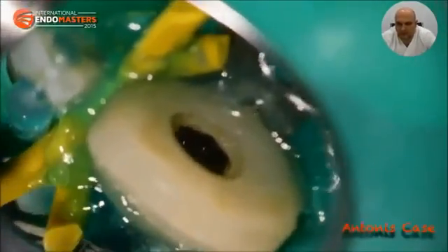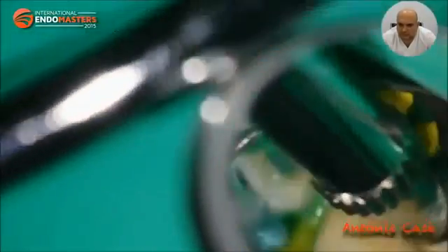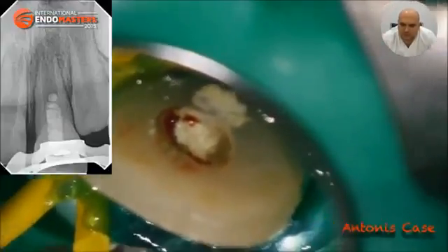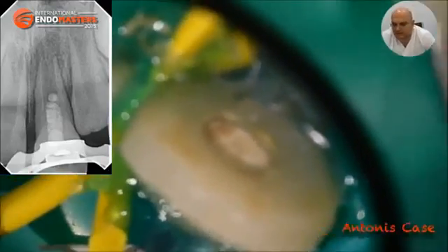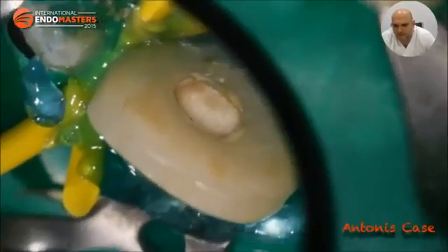In order to place the MTA, you can use an amalgam carrier, a small amalgam carrier like an MTA carrier. You deliver the MTA in your access cavity and then with light pressure you try to adapt the MTA at the level of the CEJ. You see that the first shot of MTA is mixed with the blood, the second shot will be thicker, and the third one will be able to give you an initial setting of the material. This is the clinical image, however in this case I overpressed a little bit the MTA.